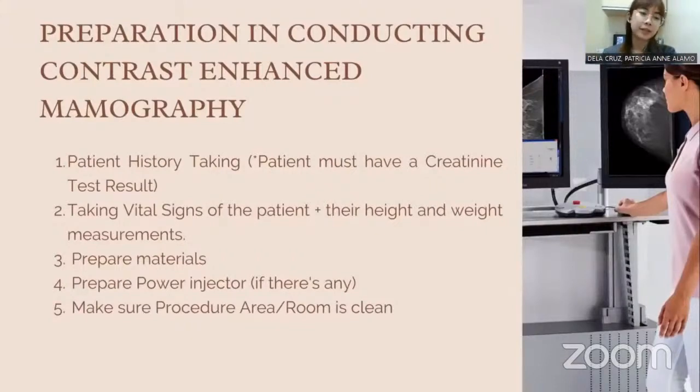We need to prepare the materials and the power injector if there's any, but having a power injector is highly recommended so that we can customize the flow rate of the contrast. It also has a preheater so that the condition or quality of the contrast is good. Make sure the procedure room is clean, so make sure to disinfect the area before and after.